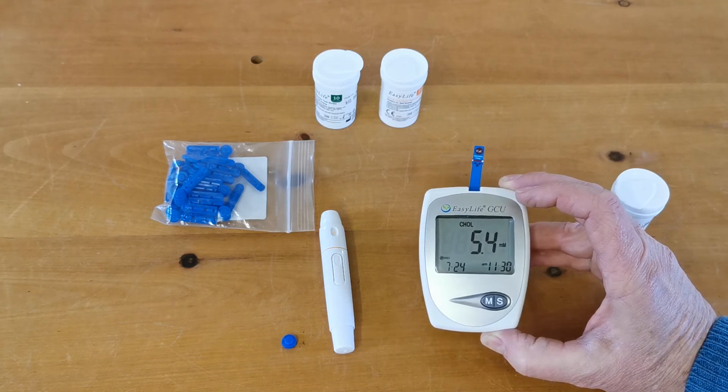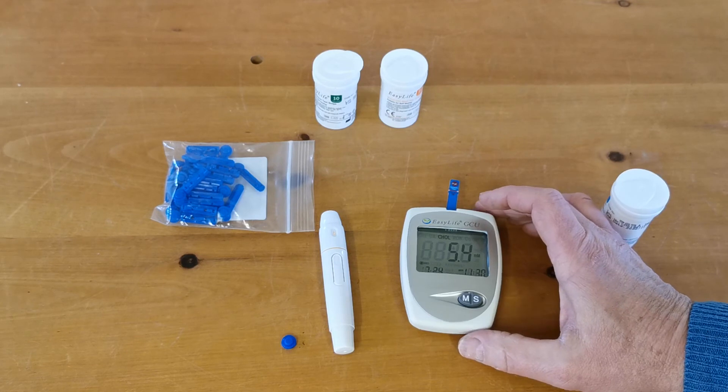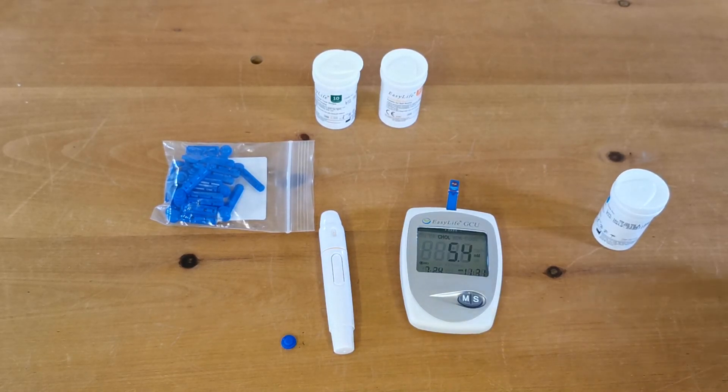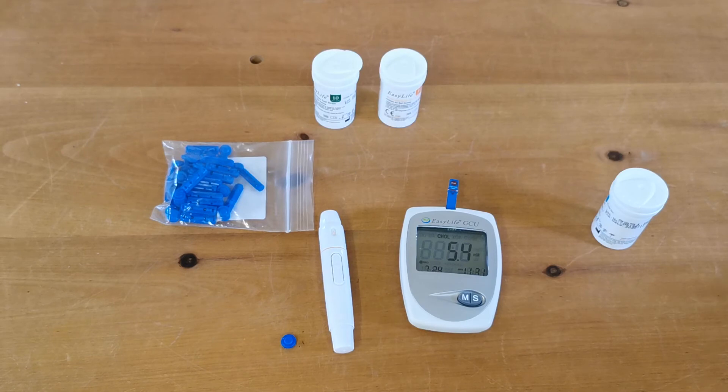Guidance on what you should be looking for obviously depends on whether you're on treatments, what your diet is, and what your doctor is telling you, but there are normal ranges for cholesterol. We give some guidance in the manufacturer's data sheet, and these are also widely available online. This is a great way to monitor the effect of diet, medication, or lifestyle changes, and to use as a screening tool within a family if there is a history of high cholesterol levels.